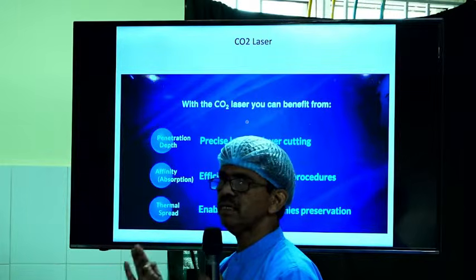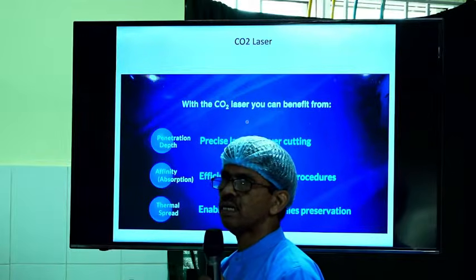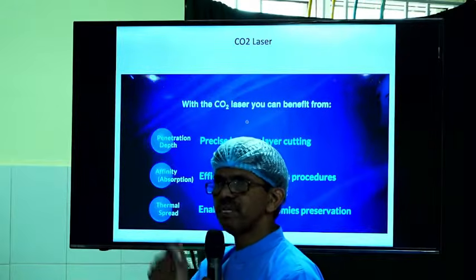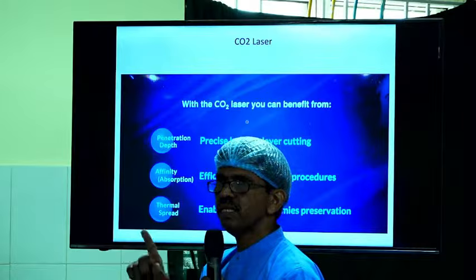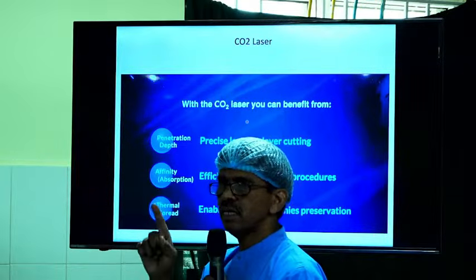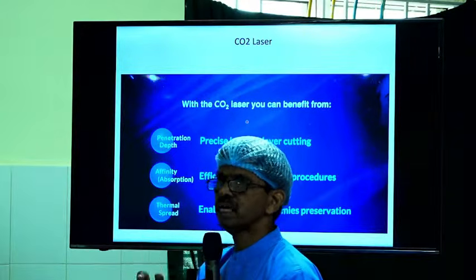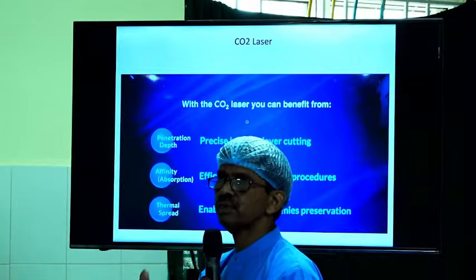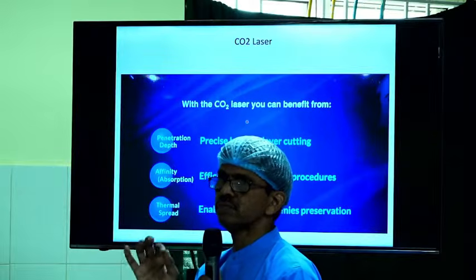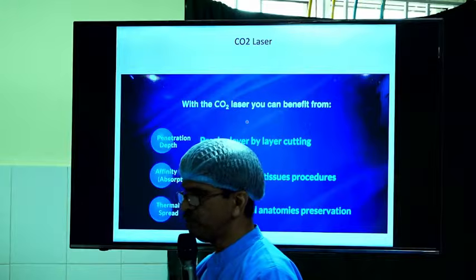So for benign lesions or even early malignant lesions, use ultra pulse or super pulse mode. All these modes are preset in the machine itself. The only thing you have to change is the buttons or the switch, and the size and shape of the beam can be altered according to your comfort, if you use these surgeries with super pulse and ultra pulse mode.